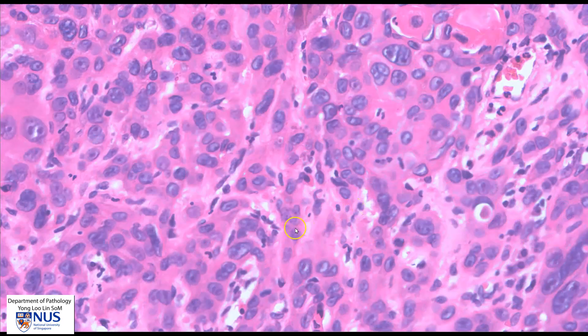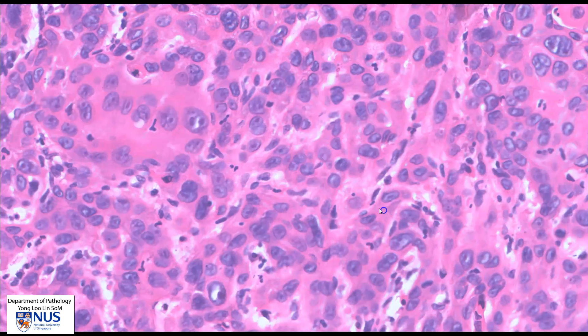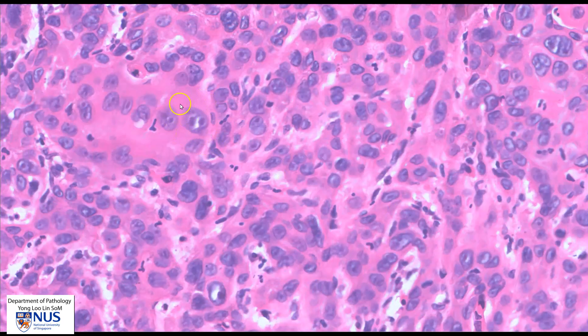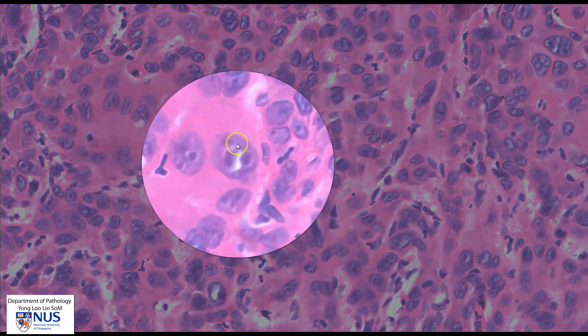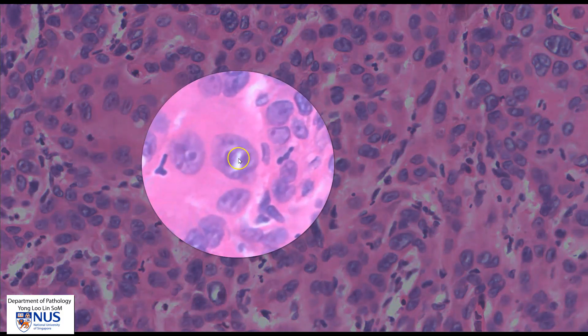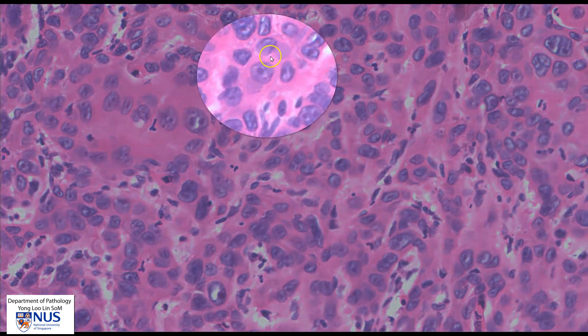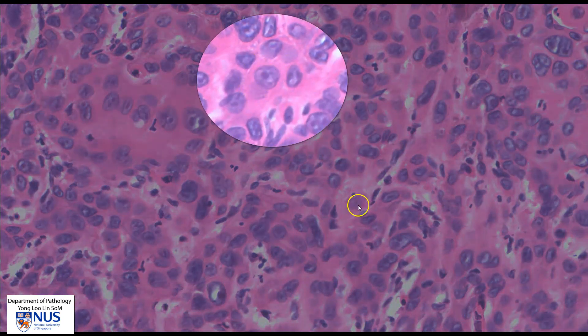Moving to this more solid area, we can see that in some areas the nuclei are quite large with very prominent nucleoli, and again here we can see a nucleus with a prominent nucleolus.